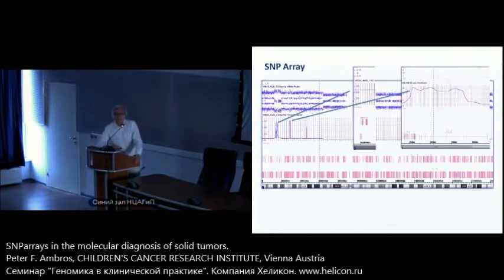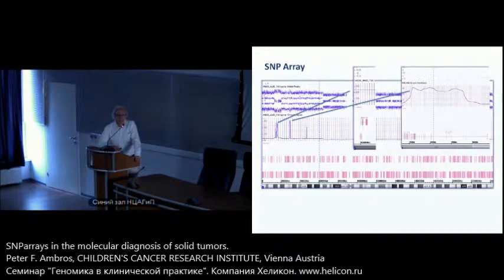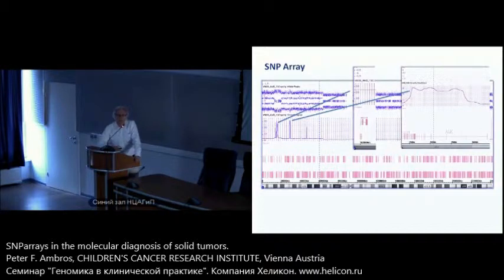And I'm not sure if you're aware, we already use ALK inhibitors in phase 1 and phase 2 studies. So it's essential to know whether or not this tumor has an amplification or a deletion or aberration in this oncogene. So we gained a lot more information. Before we had only seen double minutes, but that's it. We could only guess which genes are included.